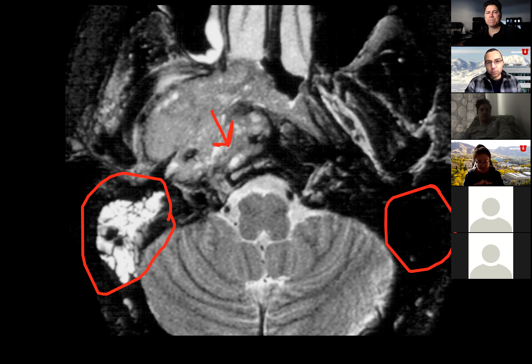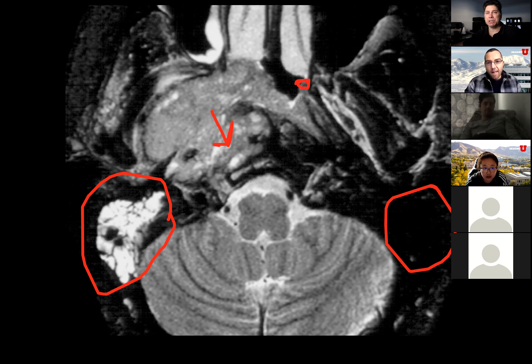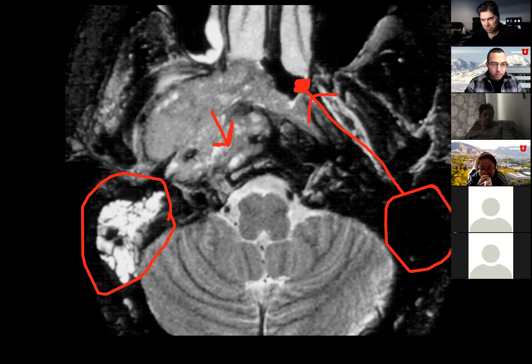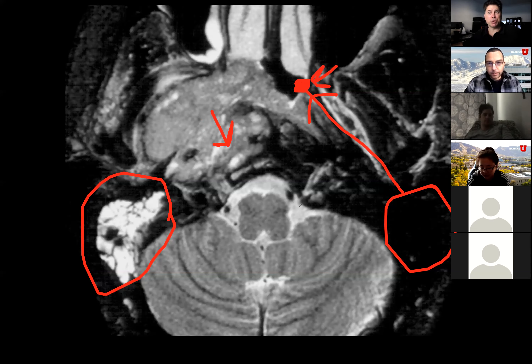There's right mastoid effusion. So if the right mastoid and middle ear are opacified, where do you look next? There's probably a blockage in drainage, so it's probably involving the eustachian tube. The eustachian tube opens in front of the torus tubarius and the nasopharynx. So anytime you see unilateral middle ear and mastoid fluid, the next thing you look at is the nasopharynx.